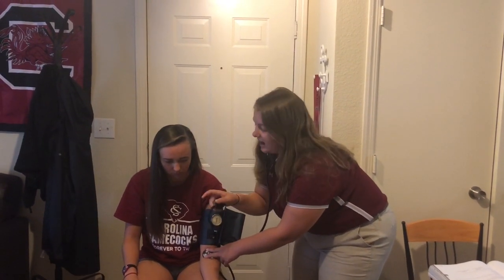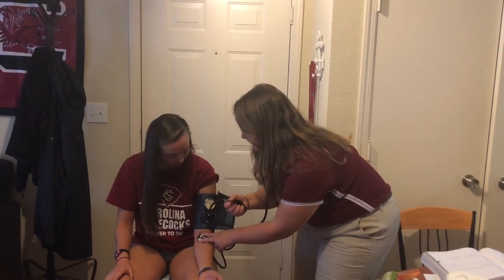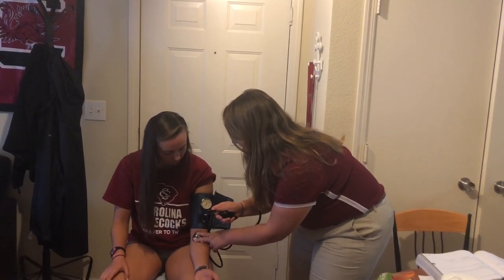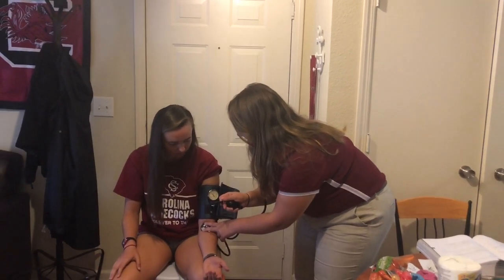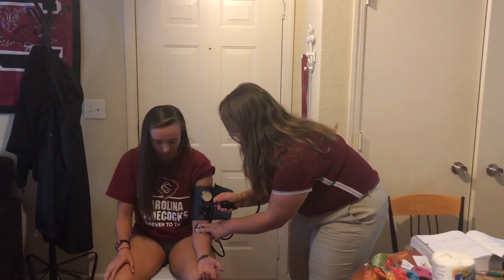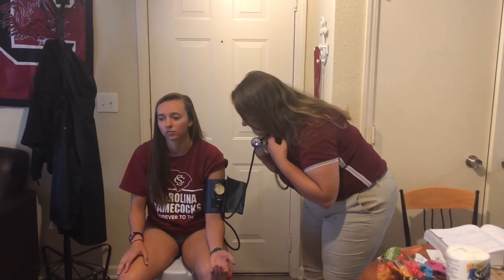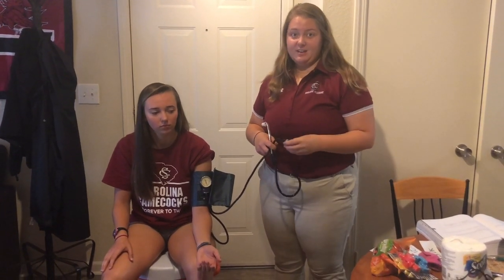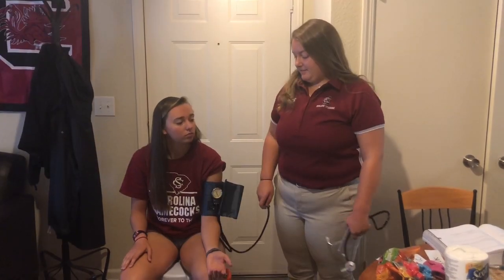Ensure that your knob is turned all the way to the right so that your pressure cuff will pump up. For my patient, I got a blood pressure of 118 over 78, which is normal — normal is typically 120 over 80. And that is all.